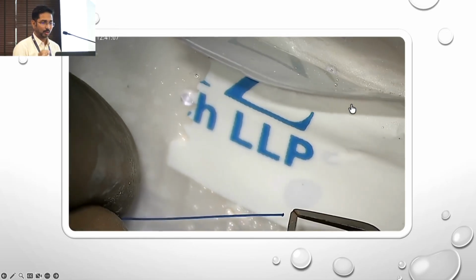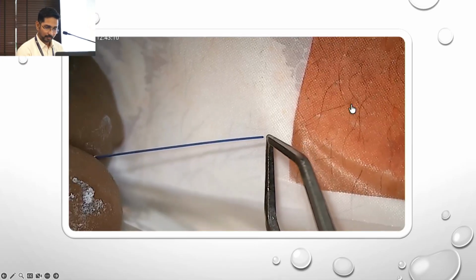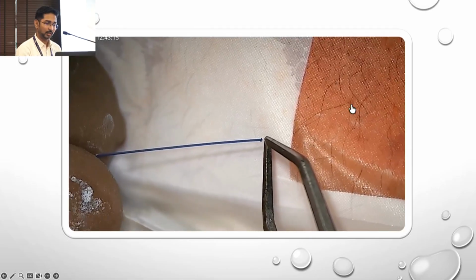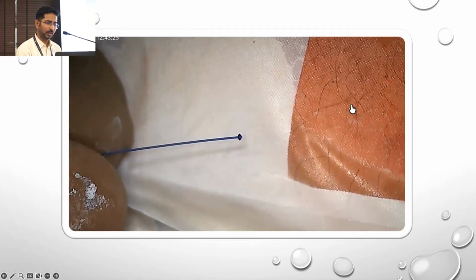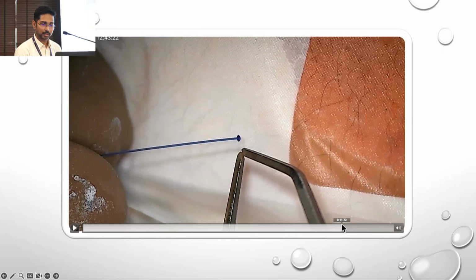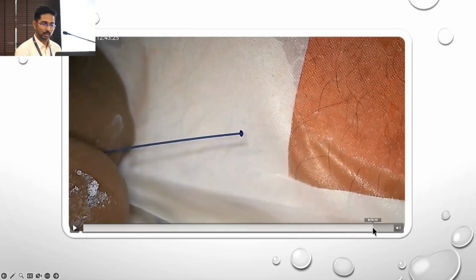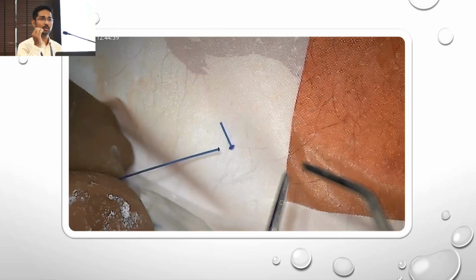So we use a normal cautery. You have to make the mushroom tip of the suture so that it does not hurt your trabecular meshwork. When you compare, you can see that there are two types of mushrooms available here: one is a small mushroom and one is a bigger mushroom. We don't want a bigger mushroom because that will not go into the Schlemm's canal. You just need to make a very tiny mushroom which is sufficient not to cause trauma to the trabecular meshwork.